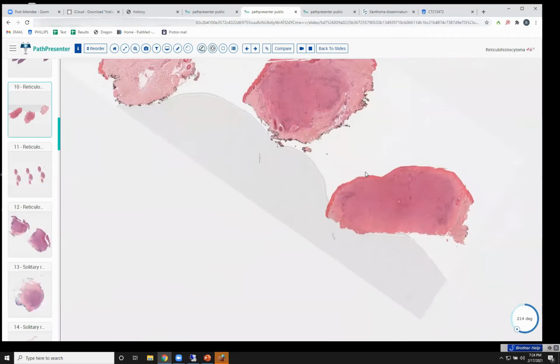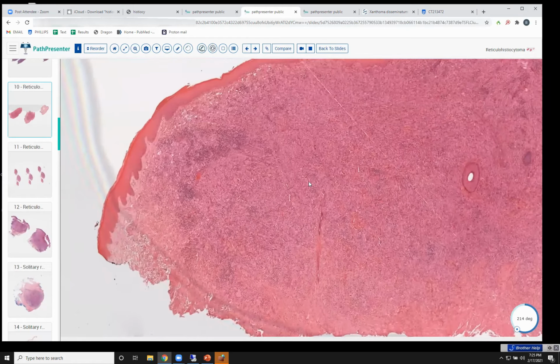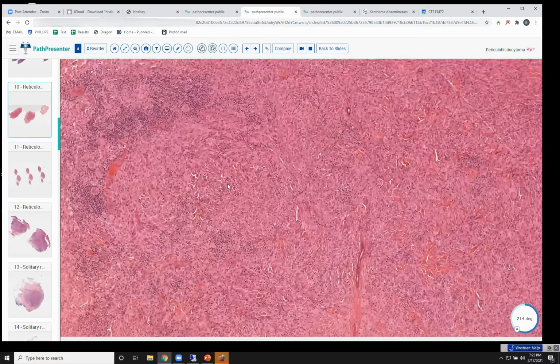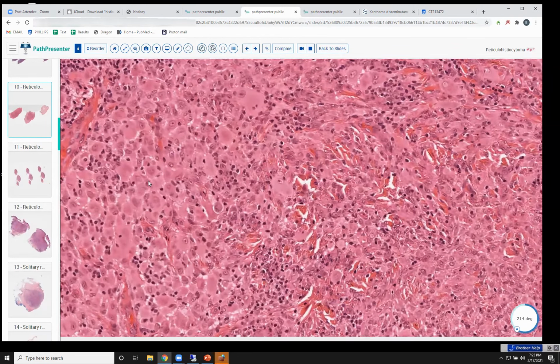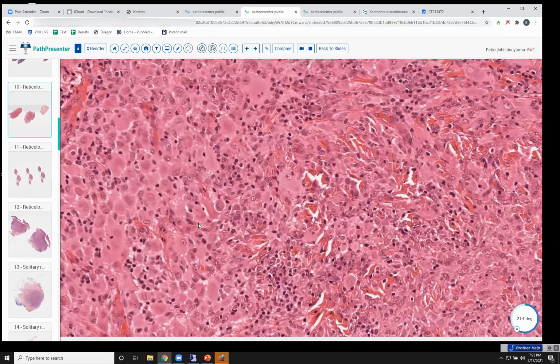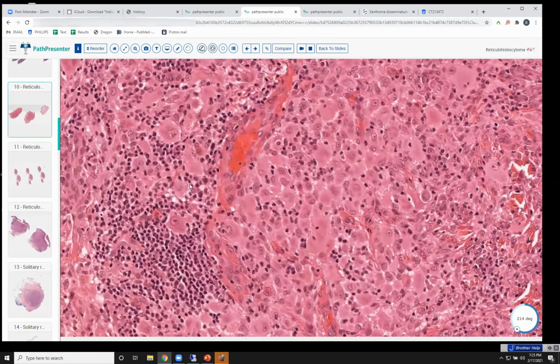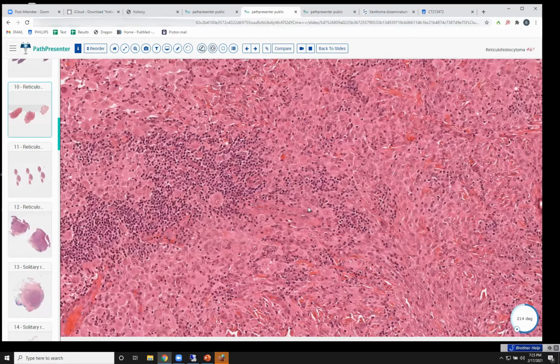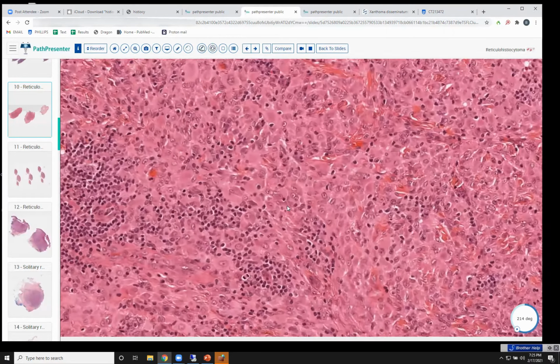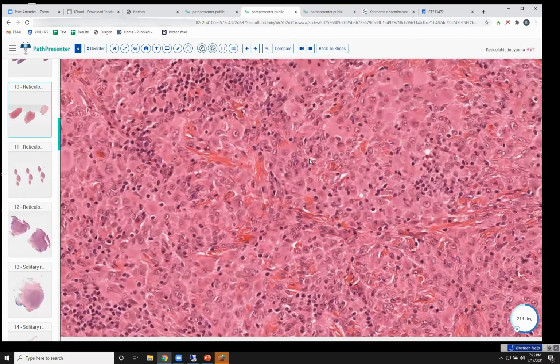And this, as you can see, is a very similar dermal process with replacement of the dermis by a dense cellular infiltrate. And these cells, you're not seeing Touton-type giant cells, you're seeing this very pink cytoplasm. See? This ground glass is the buzzword for it, together with lymphocytes, sometimes eosinophils, giant cells you definitely can see. And these kind of oncocytic cells are reticular histiocytoma.